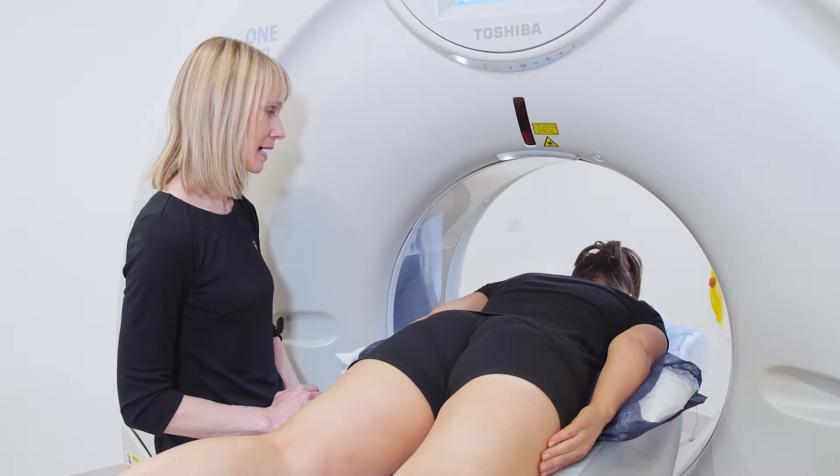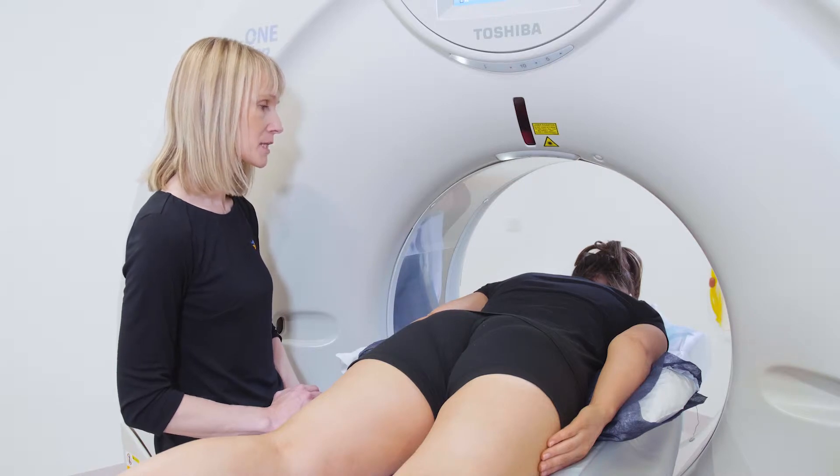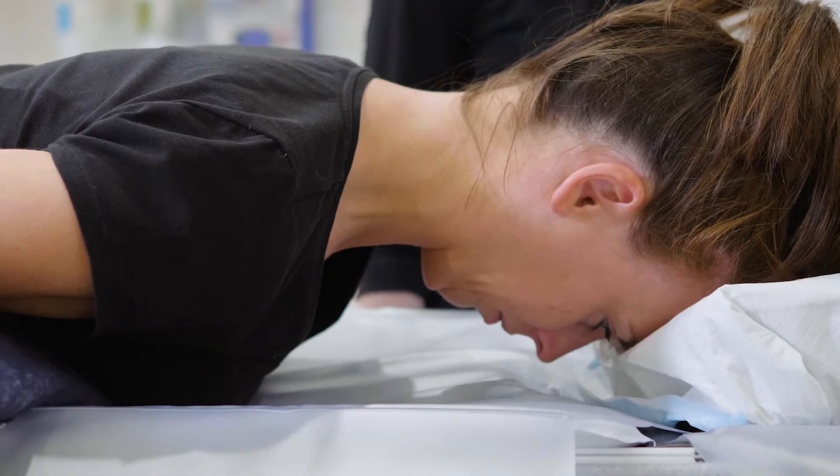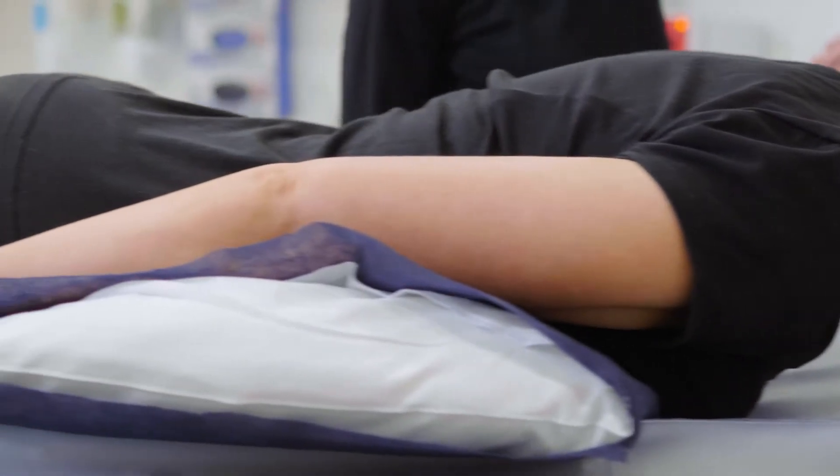Very important to have a gap between the shoulders and the table to allow the shoulders to rotate adequately. Two cushions under the head and a pillow under the chest.